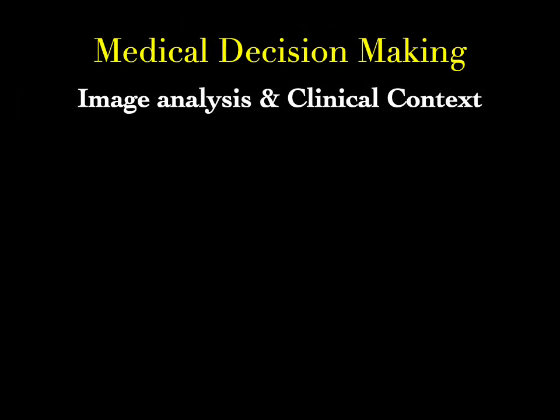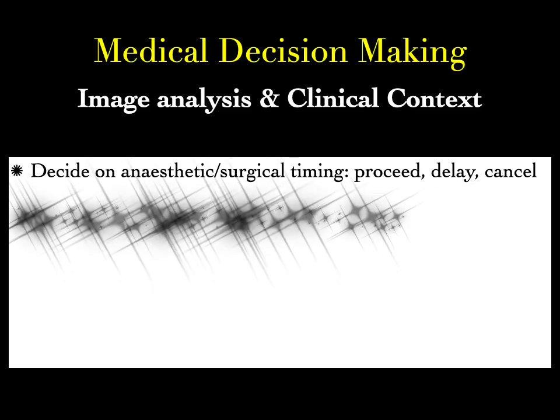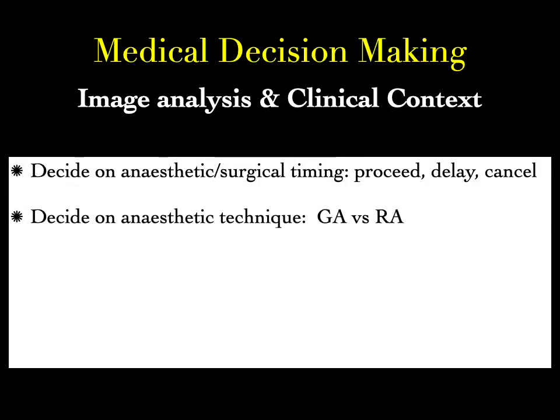Okay. Now, decision making. Now comes the important thing. Depending on what we find, we can plan whether we should continue the anesthesia or not. If we continue, what steps we can take to prevent the aspiration. So it is not about cancelling a patient, it is about helping us choose the appropriate technique for the patient.